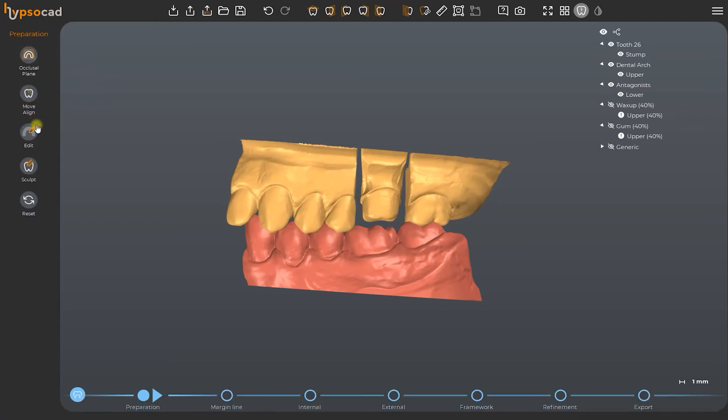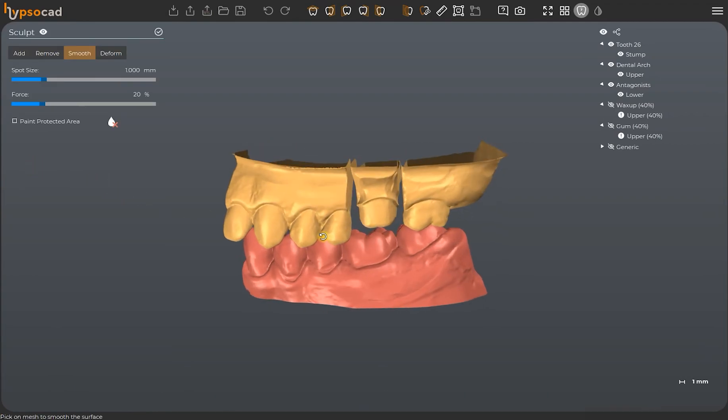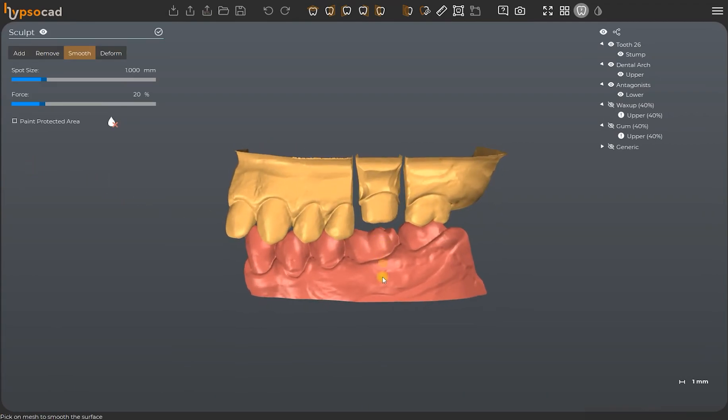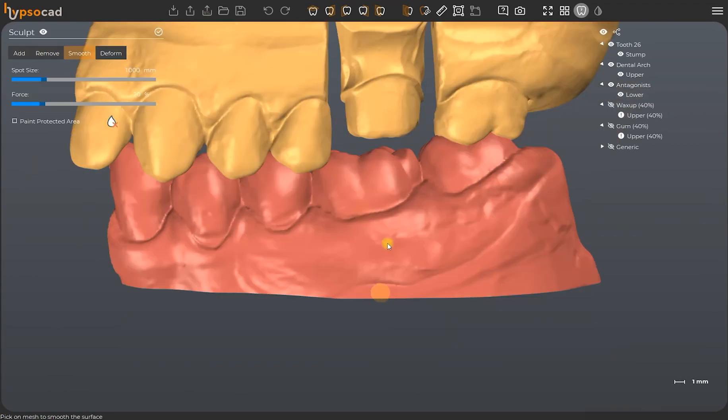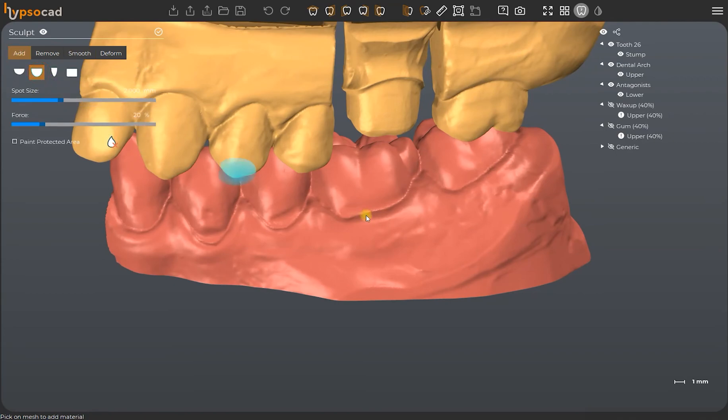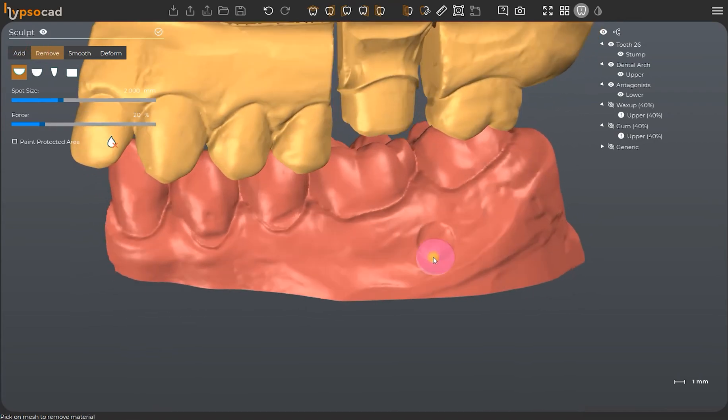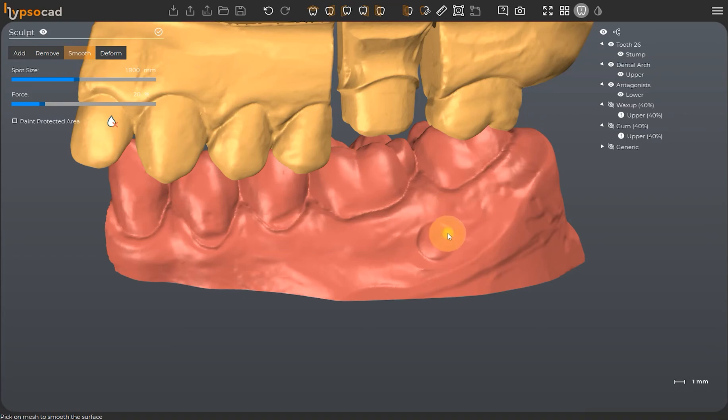We select the sculpt tool from the menu on the left so that we can modify the scan data. Specifically, we may add, remove, and smooth the scans.